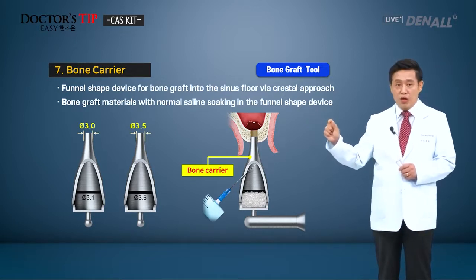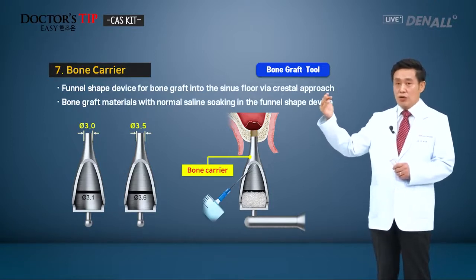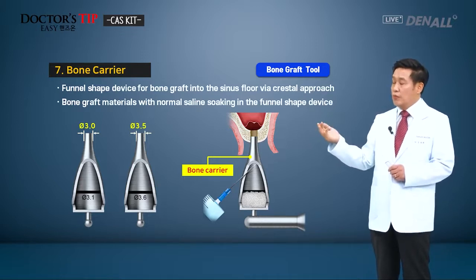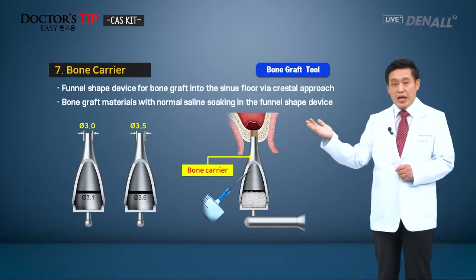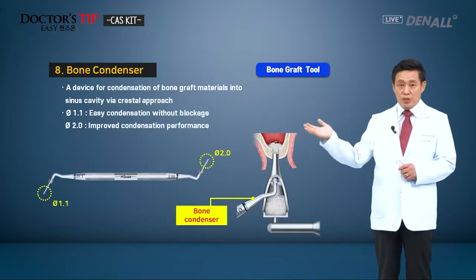The tip length is shortened. In the past, the tip was longer. When you push it into the sinus membrane, sometimes the membrane was damaged, so the design was changed recently.